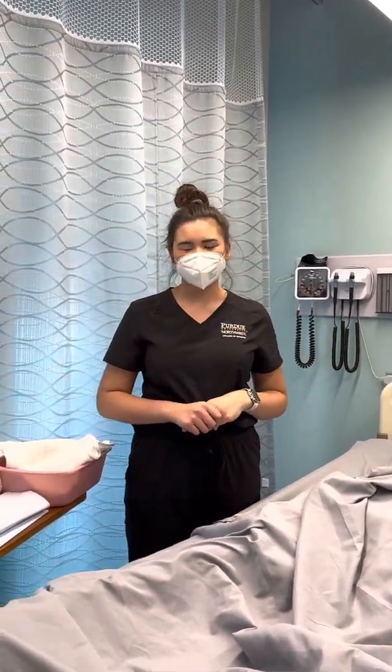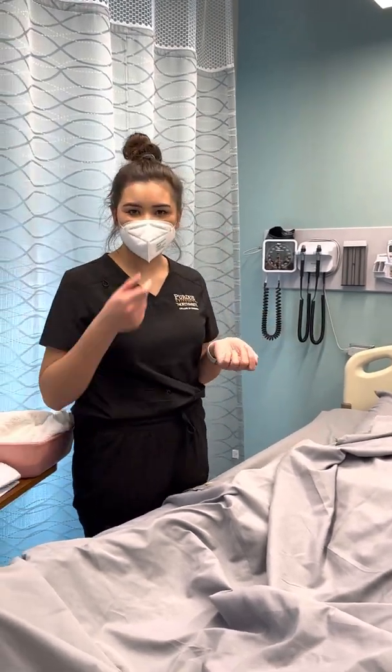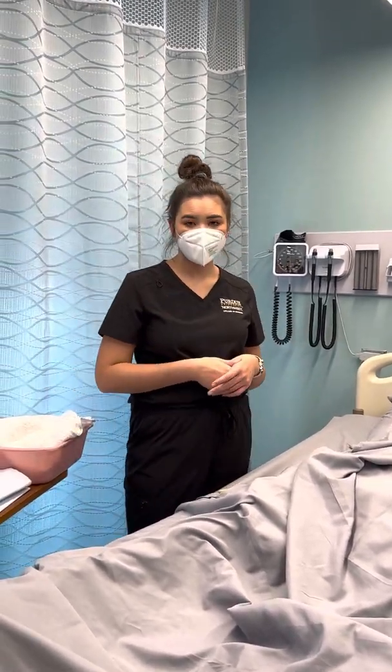Hello, my name is Isabella Gozo and today I'm going to be doing my catheter instruction on a male patient. First thing I'm going to do is check that there's an order in it on the e-computer and make sure that's all good.